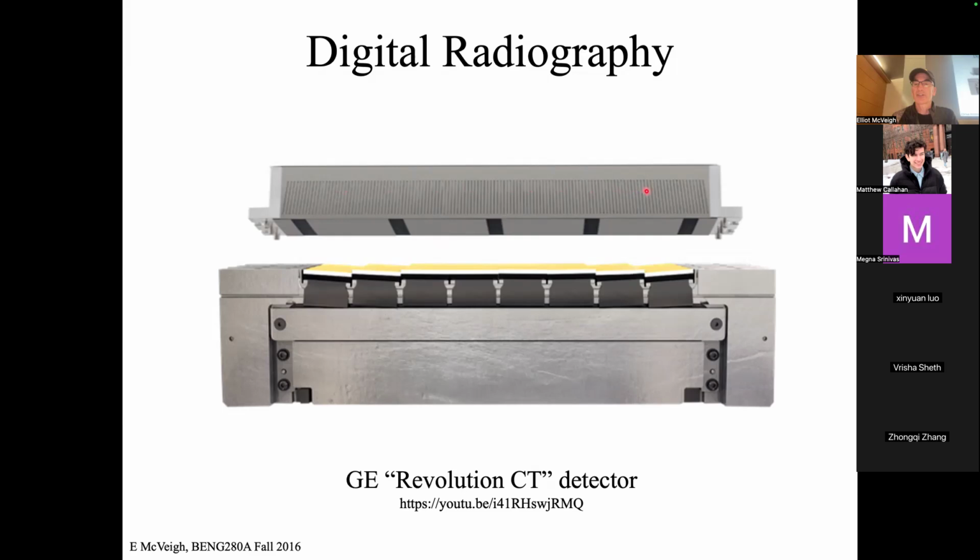This is the anti-scatter grid that clicks down on top of this detector grid, such that photons coming through this way just get stopped by the grid. Photons coming straight from the target will go through. And then this generates a little flash of light, and then there's a photodiode and signal goes out. 256 points along here, along the Z direction, and then there's 1,000 points in the orthogonal direction.